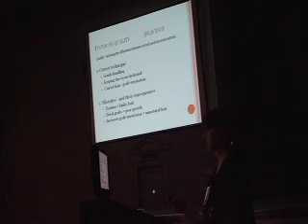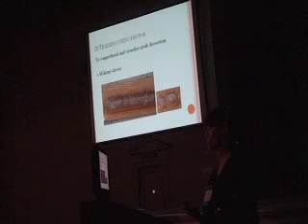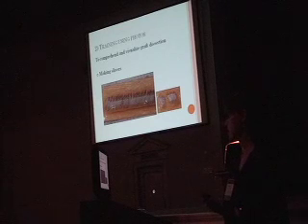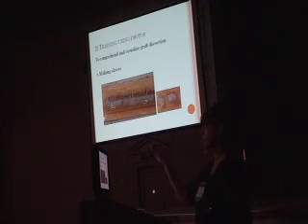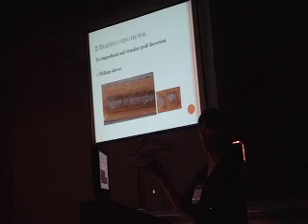Done wrongly has its consequences. And then the second portion of this training is using photographs. As I mentioned earlier, I take a photograph of a tissue, and then I show them the different paths the blade can make to create slivers.